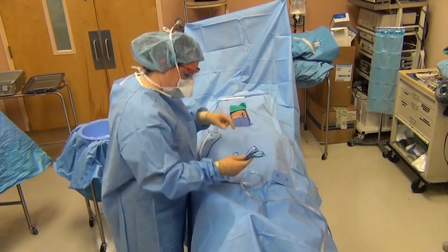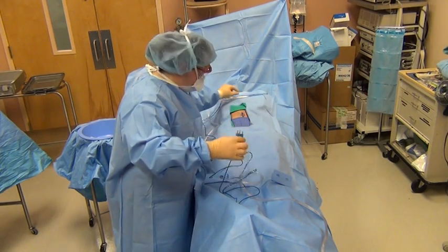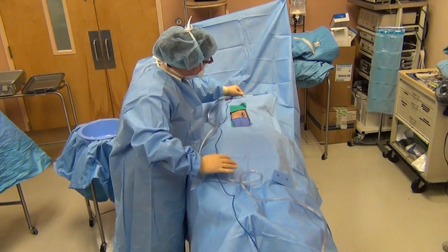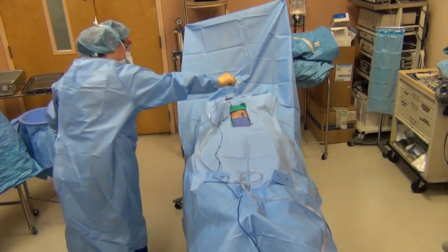Notice she's very careful to keep control of everything to make sure that it stays on the bed. If your circulator or RN is not there right away to plug everything off, you just throw it off on the end that it will be plugged up on.